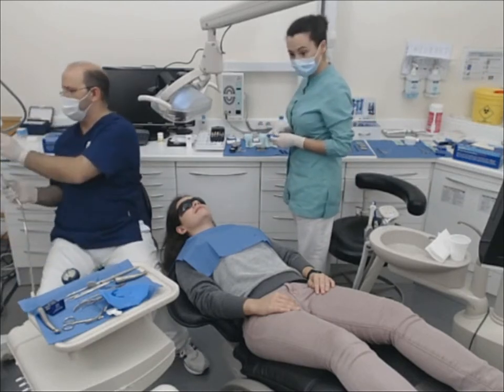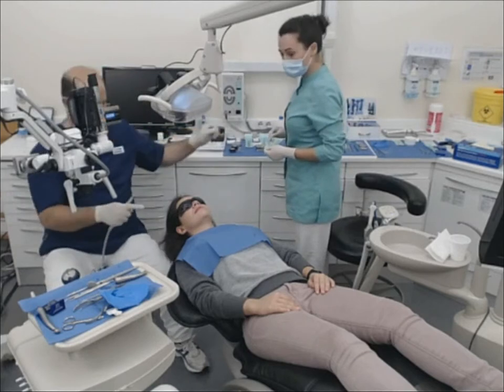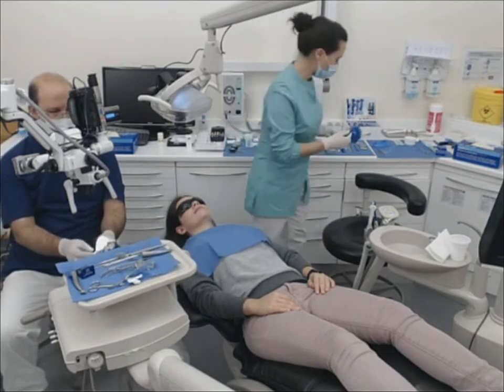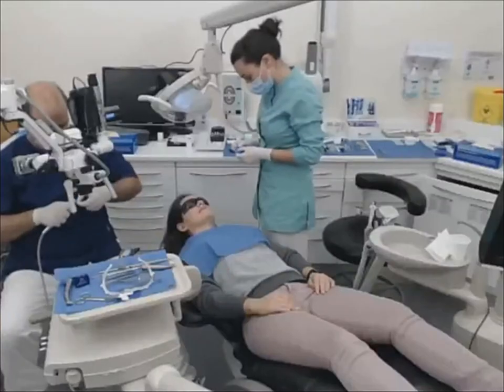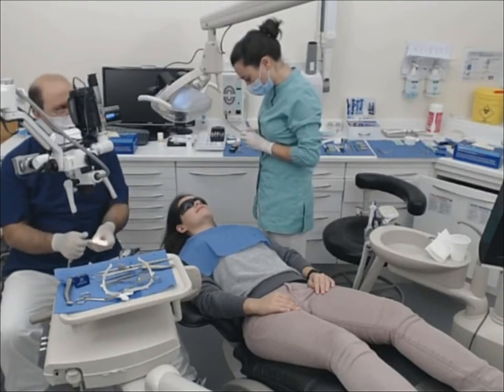Now maybe I can use the microscope so you can see better. And the first step is to cut the sprue. Okay. So we have the sprue here. With a diamond wheel, we're just gonna cut this sprue.